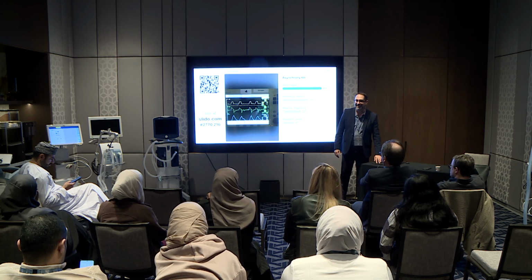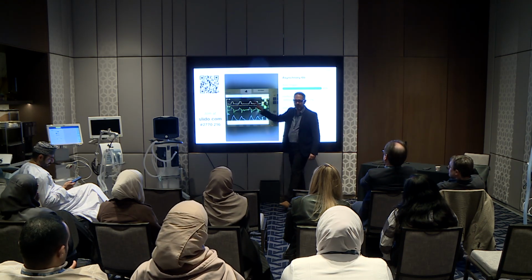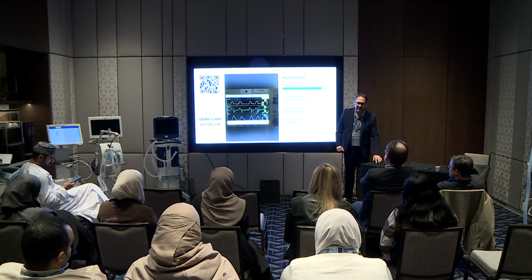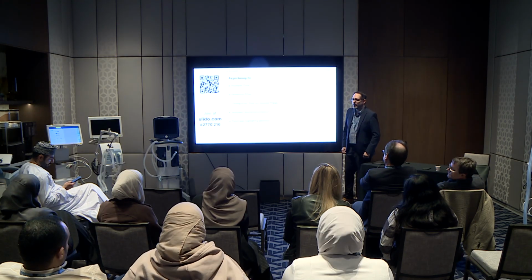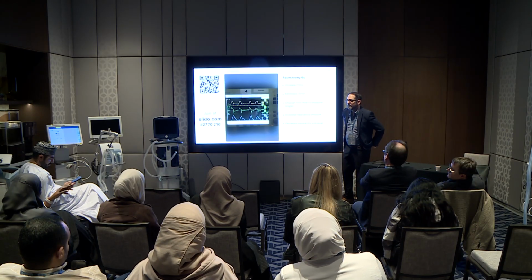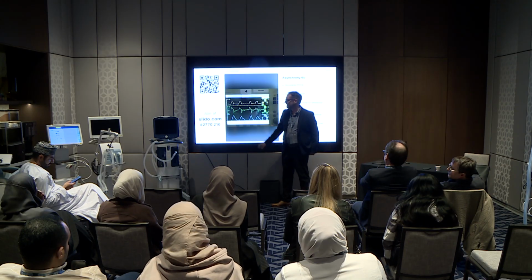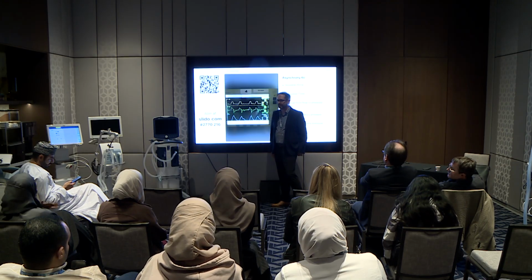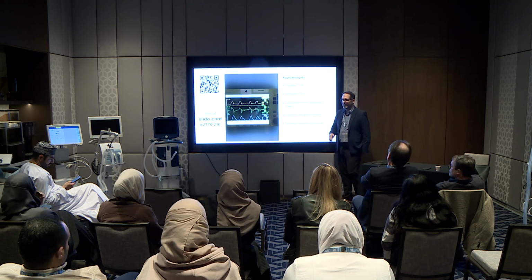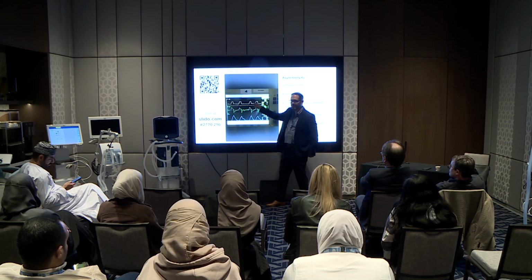Water in the circuit. What's that? Water. It can be, yeah, water can do it. Water's not likely going to be as constant. Like this one, it was very clear that it was likely cardiac oscillations. This is the patient. It's their cardiac oscillations, their heart. Not the pacing. No, just regular and ineffective. So if you held an inspiratory pause and counted that, it would be their heart rate.